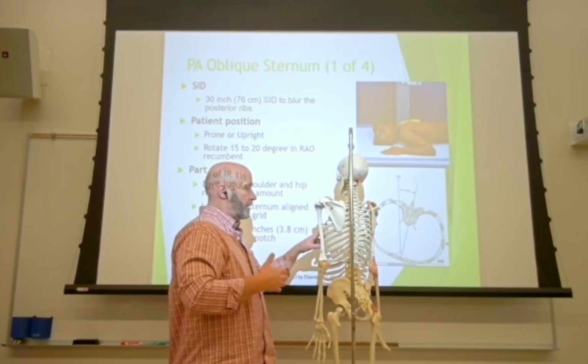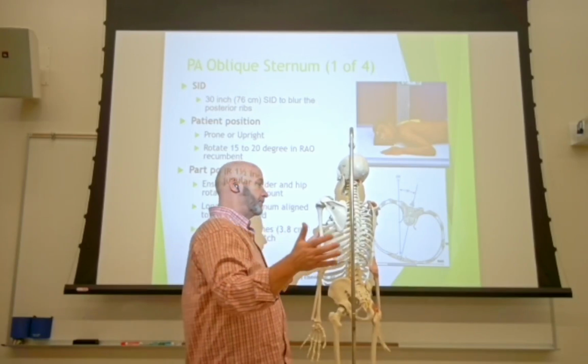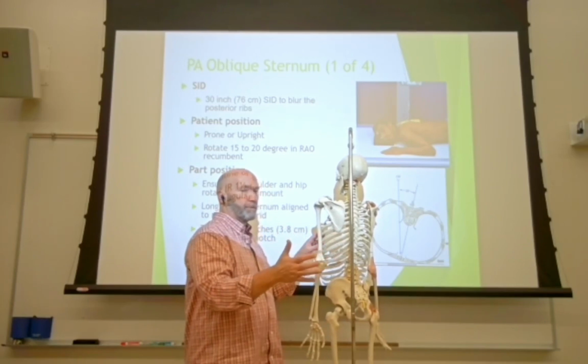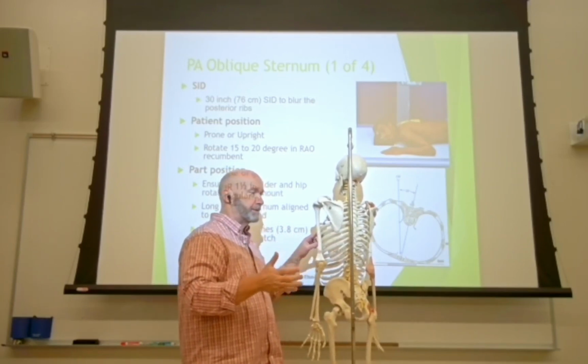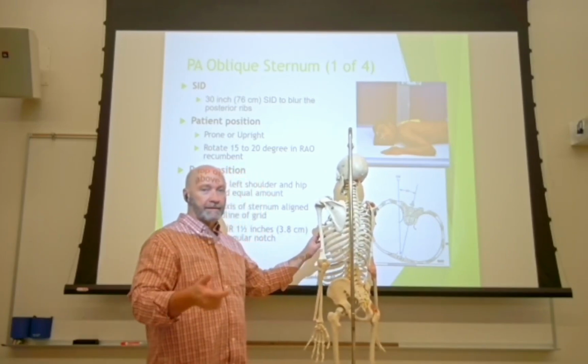And then what we're going to do is a breathing technique. If your machine will allow you to come into 30 inches instead of 40 inches, some of your machines will just lock in at the detent and they won't allow you to reduce your distance. So come in 30 inches and then you're going to shoot a breathing technique.